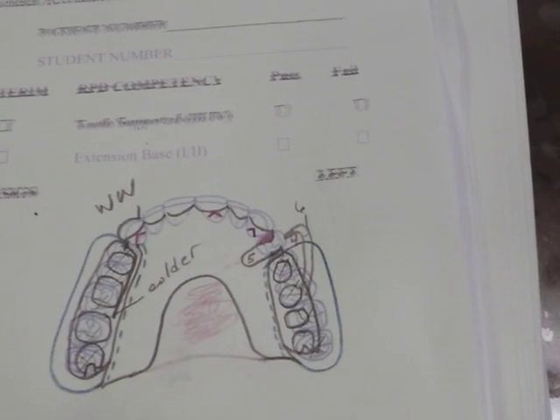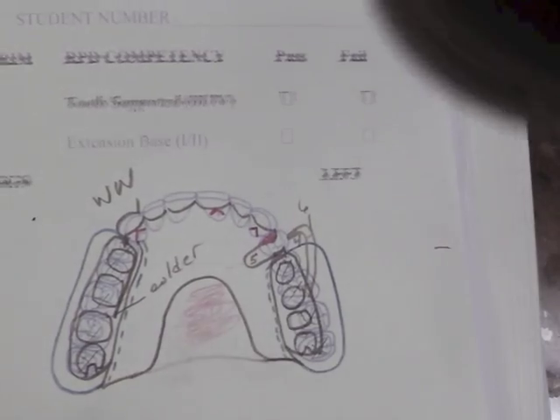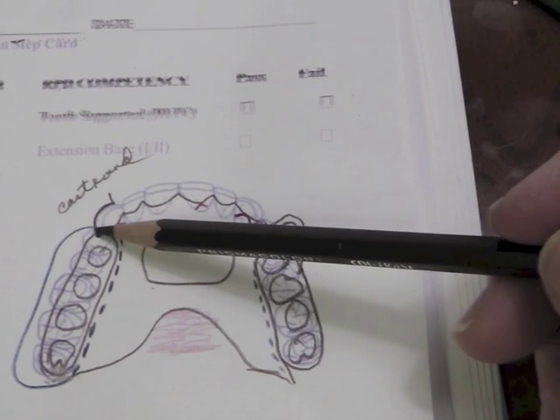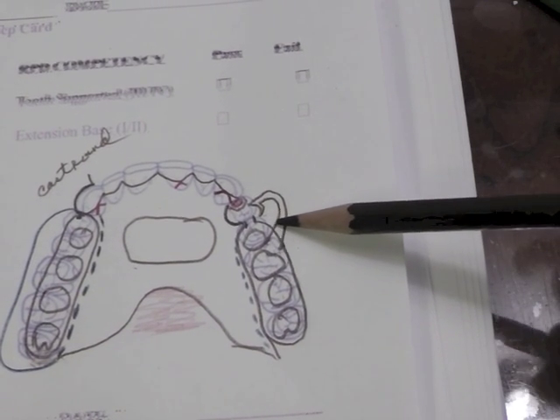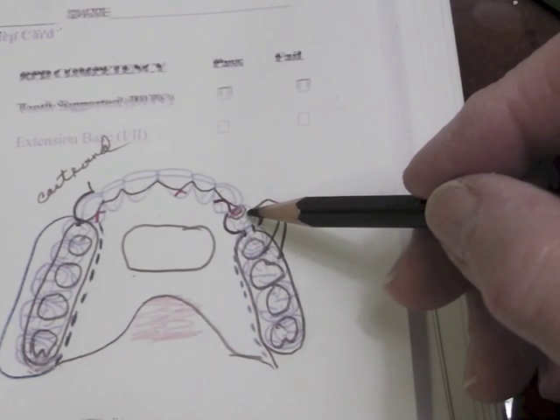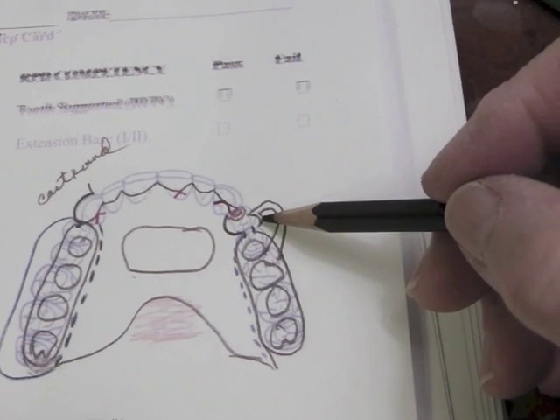I have some other designs drawn up. This one is basically the same thing where I came in a little bit farther. I forgot to add those solder joints for my wrought wires on that last one. In one design I used a cast round clasp which doesn't solder — it just emerges from the framework right at this point on one side — and on the other side I did the modified T-bar going to the distal facial. When that bar comes up it goes above the survey line, and then this little component area swings back into an undercut.